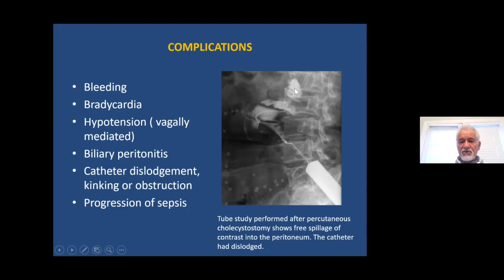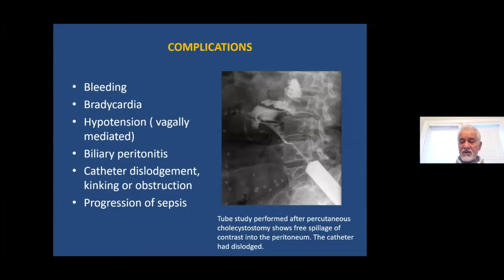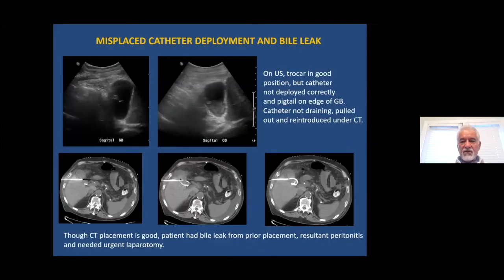Here is contrast outside of the biliary tree, in the peritoneal cavity, as a result of cholecystostomy — where the catheter has been dislodged outside of the gallbladder. Sometimes a side hole of the catheter may be outside the gallbladder, because catheters have several side holes — one at the end and many along the sides — and some may be outside the gallbladder wall while others remain inside, causing leakage of gallbladder contents.